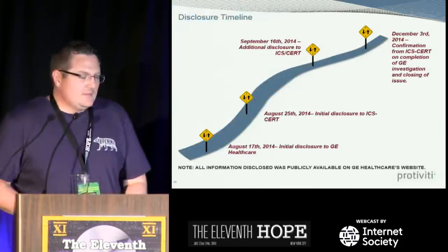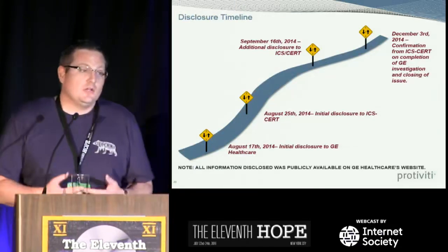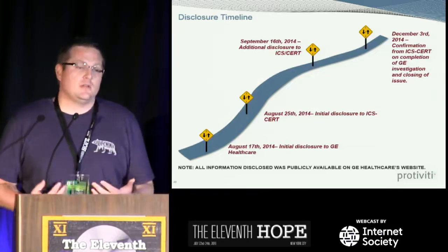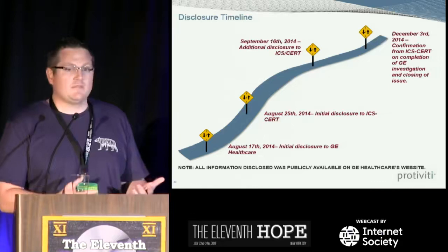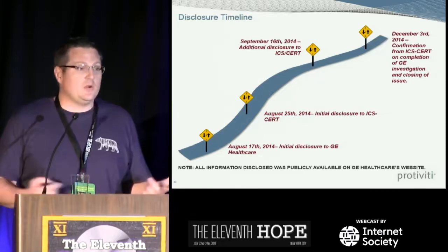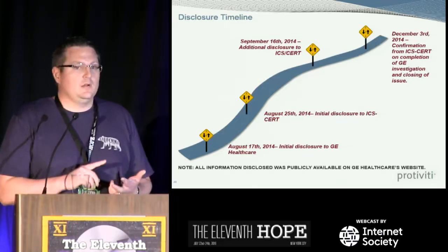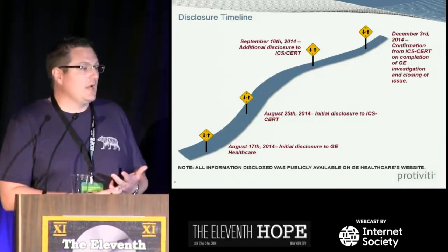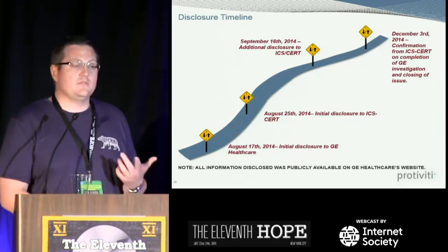So we said, okay, we have vulnerable devices, and you know what? They are directly accessible to the internet, either directly, which I didn't touch on. If you go and watch a DEF CON talk, we did find infusion pumps, patient monitoring, all the way up to high dosage radiation systems like linear accelerators directly connected to internet-facing IPs.